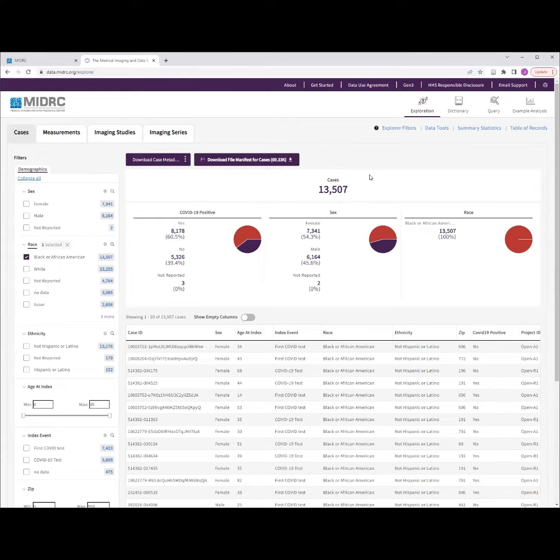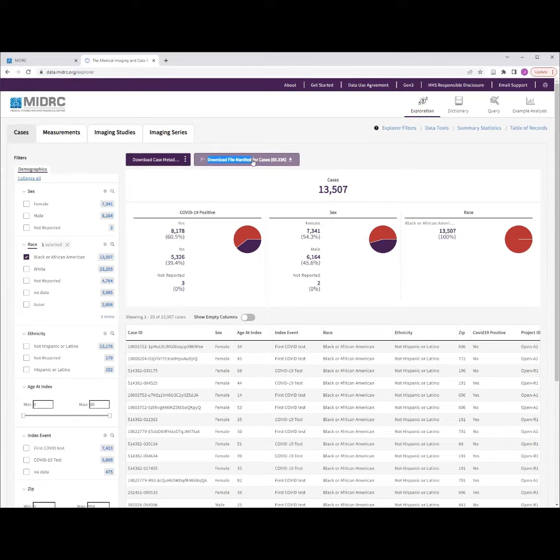Once you are satisfied with your selected research cohort, you can begin the data download process. The first step is to download the file manifest using the Download File Manifest for Cases button located here.